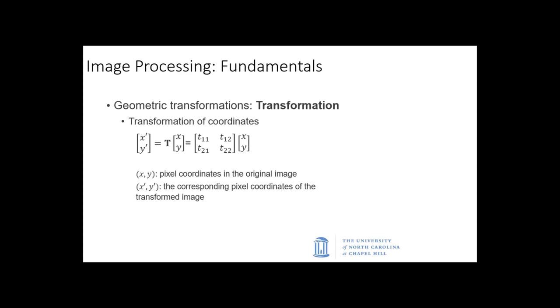All right. So the simple geometry transform is translation. So basically, we just need to estimate the parameters. So this is very general. This is the 2x2 matrix. Here we just make it simple. This is the 2D case. It is easy and straightforward to extend to 3D. So basically, we need these 3 or 4 parameters which control the rotation, translation, and the scaling. Right. So we can move on.